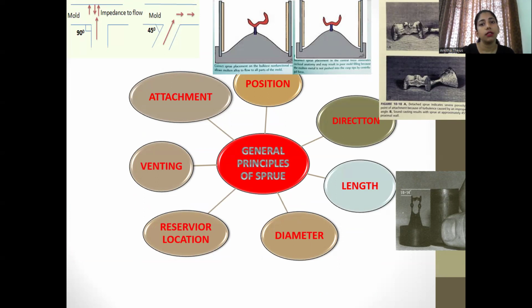There are general principles of placement of the sprue. The positioning of the sprue is very important in the casting procedure.